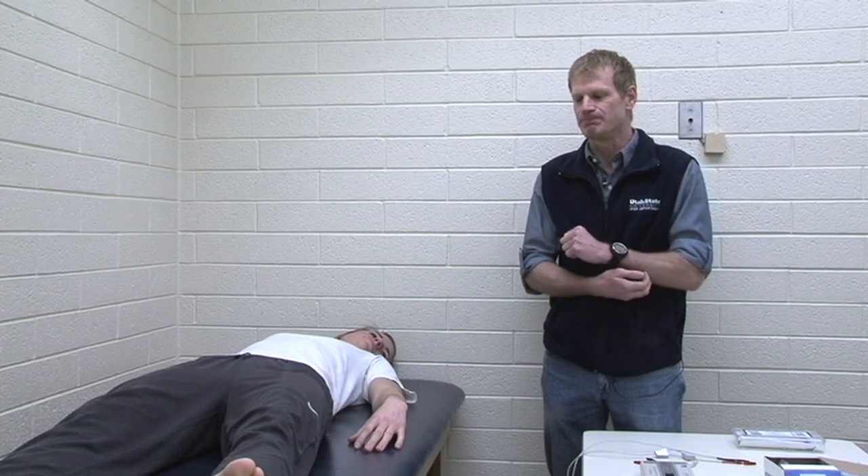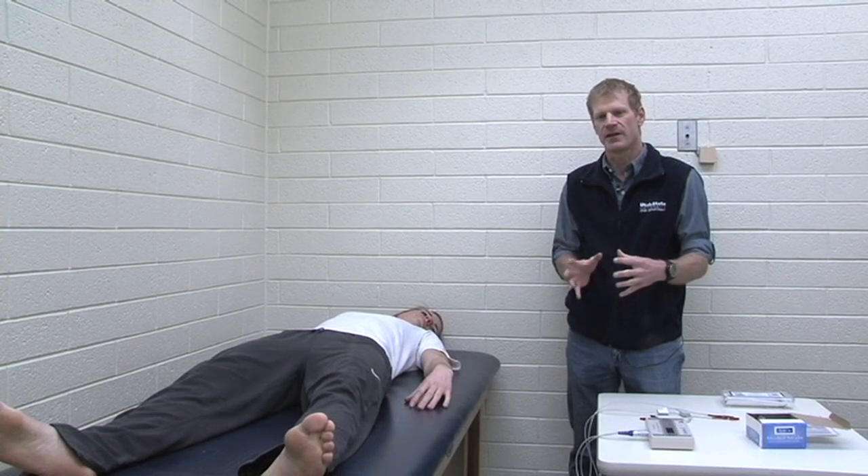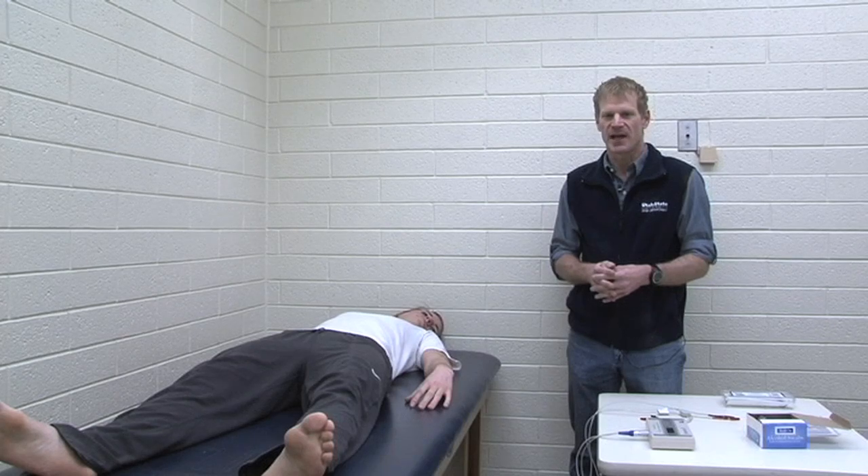BIA sends a low-level electrical current through the person's body. It's so low that the person can't feel it — it's a low-voltage, low-frequency current. A large portion of the body is water, so generally we're good conductors. The water content in the body is found in the fat-free mass, so the fat mass is essentially anhydrous, or free of water. Really the only thing that's impeding the current is the fat mass, and that's what we're measuring when we do bioelectrical impedance.